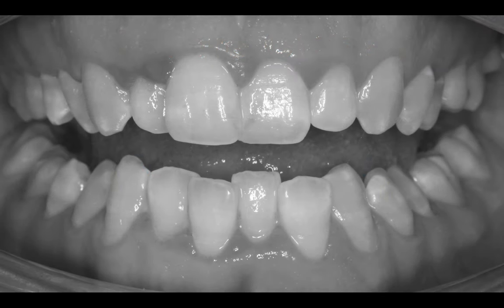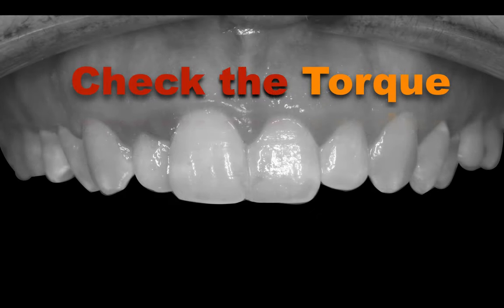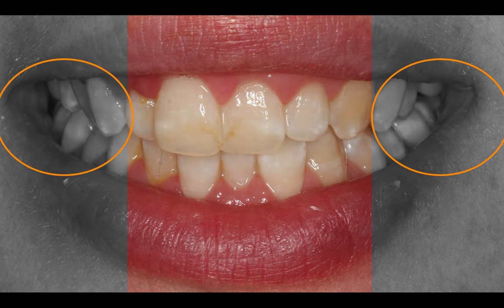If we check the torque and the angulation of the different teeth in the upper and lower arch, you can see how we have a negative torque starting from the canines and more torque in the premolars. We have a really narrow upper arch, and trying to compensate, the lower arch is also inclined to the inside. That's why we have to check the torque of the teeth before deciding what protocol to use.